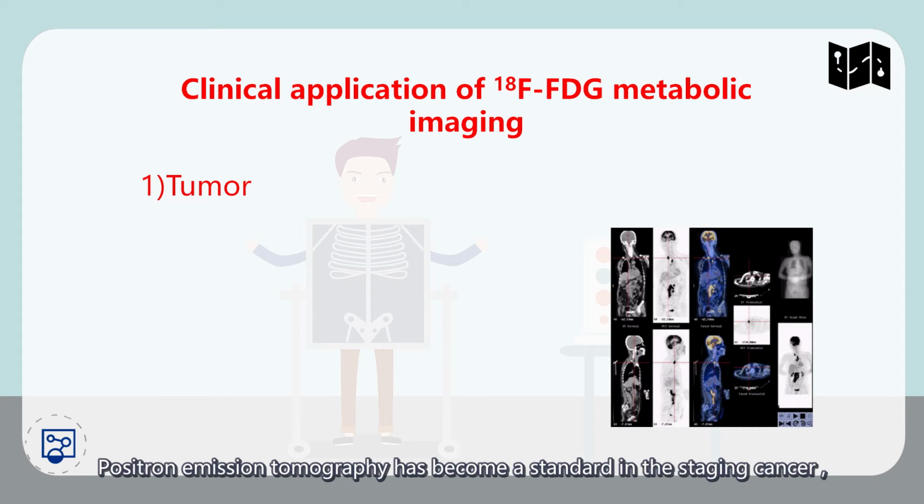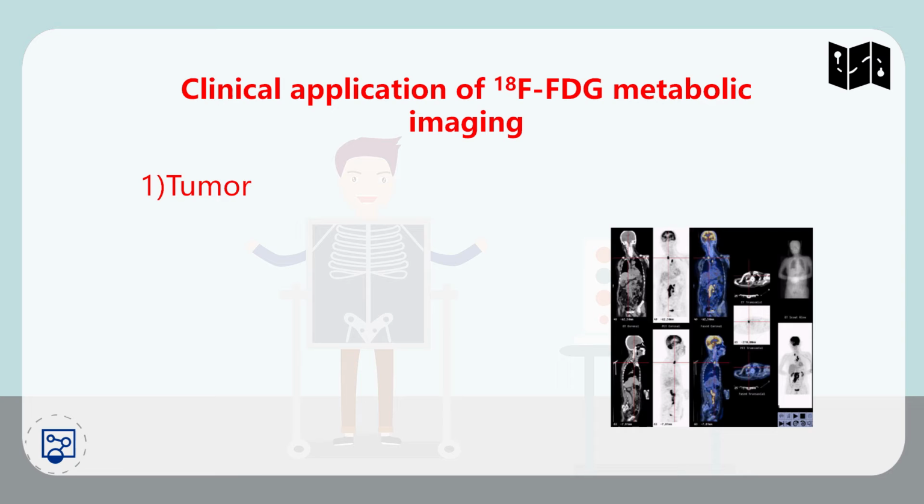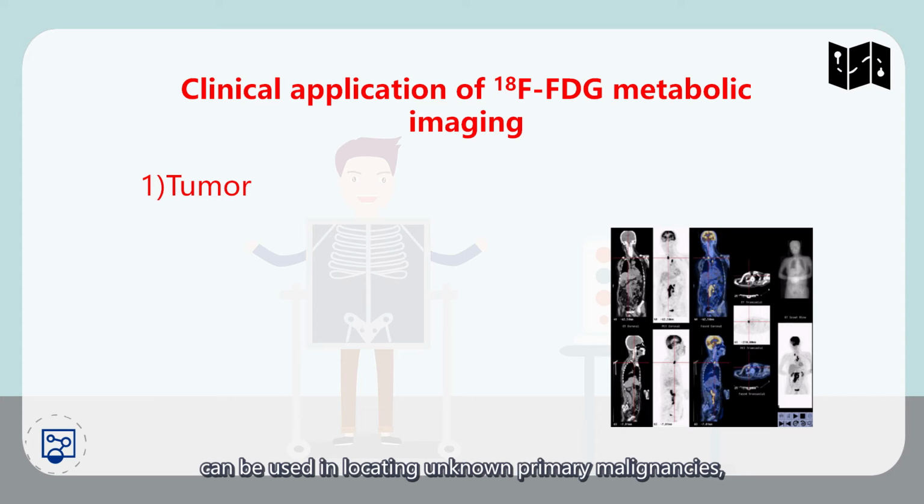PET has become a standard in staging cancer, and can also be used in locating unknown primary malignancies, monitoring disease response, and identifying disease recurrence.